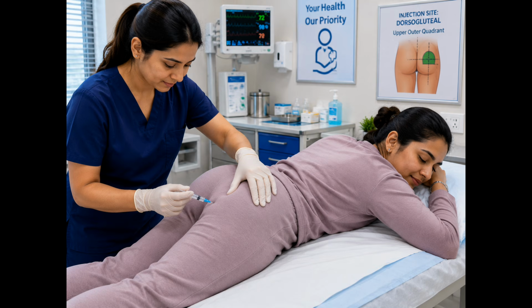Before any injection is given, the healthcare professional begins by reviewing the physician's order and confirming the patient's identity. The medication label, expiration date, and dosage are checked carefully. Hand hygiene is performed, and all required sterile supplies are prepared in a clean environment. These safety checks help reduce the risk of medication errors and infection.